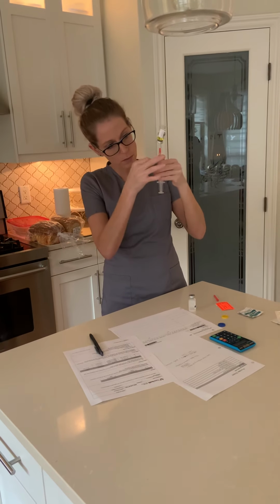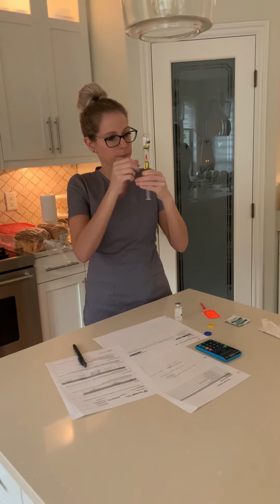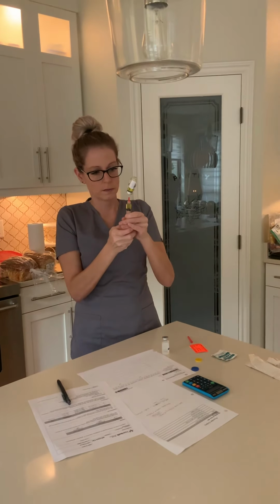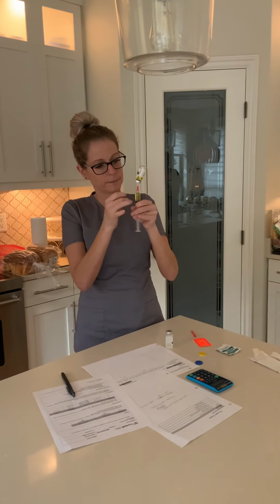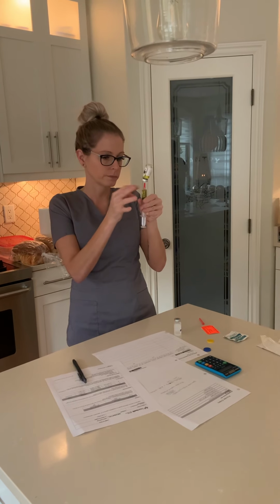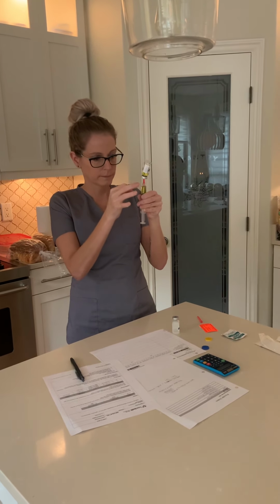Make sure there's no bubbles, there's a big one there. Okay.